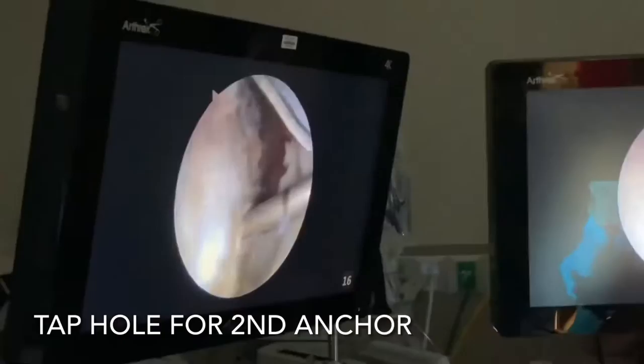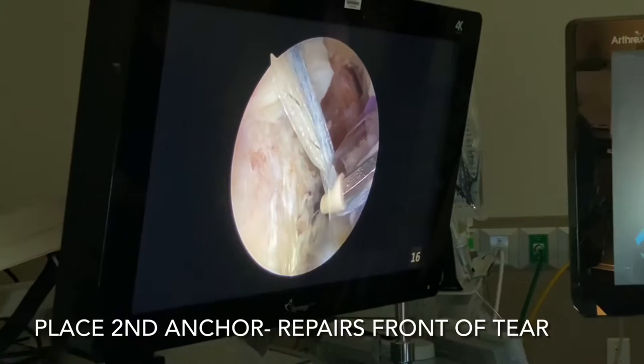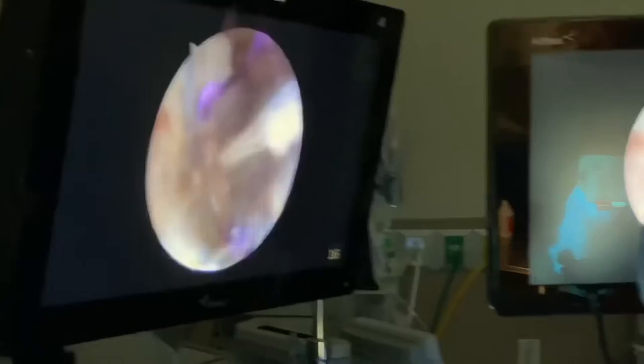Let's mallet down the second lateral anchor — go ahead, Nick. Go ahead and slide down the cutter over the sutures and cut. We've got our second lateral anchor with the sutures in there, as you can see. We tapped our hole, so I'm going to stick it right in the hole here and mallet that down — go ahead.